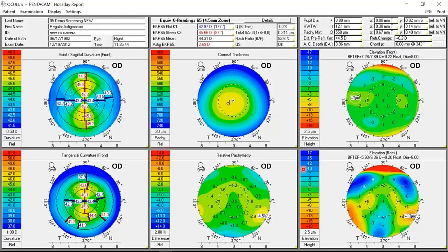The layout is designed so that if you have an electronic medical record you can have this PDF in front of you with all the information, because as a physician you don't have time to sit at the instrument and flip through several reports. Everything you need to know is on the first or second page. Demographic information is in the first window. K reading information — including spherical aberration — is in the middle upper window. This is important for IOL calculations and selection of aspheric lenses.